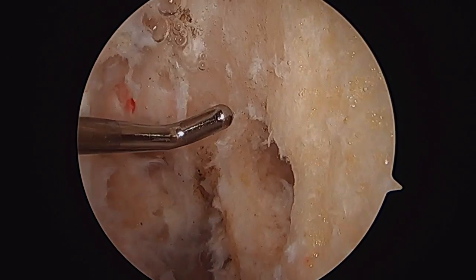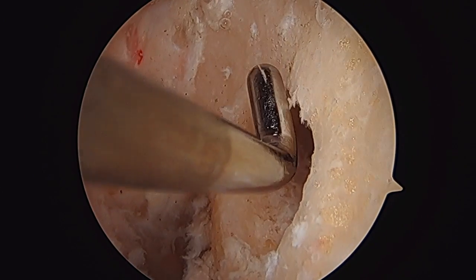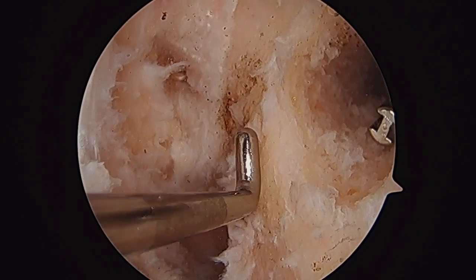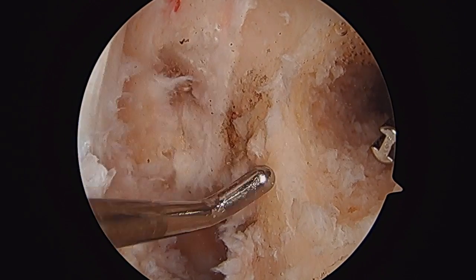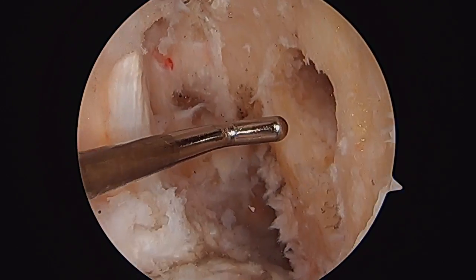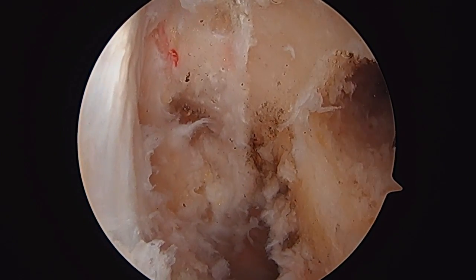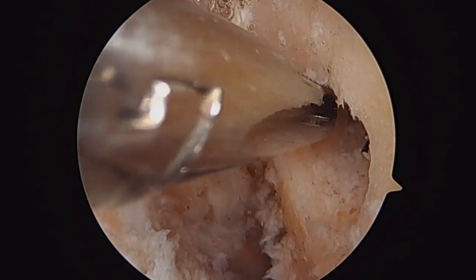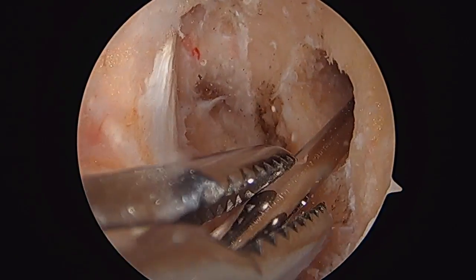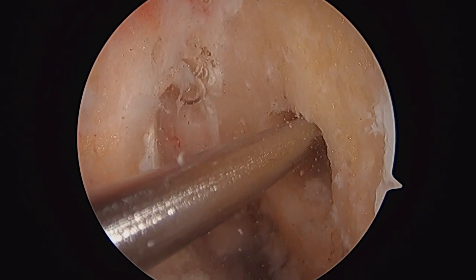So again, I like the placement. Again, it's below where I want. It's behind that anatomic footprint. I've got the back wall close to where I want to be. And this is the time where I'll do my final drilling, depending on the size of the graft being utilized. This technique can be used for hamstring grafts. It can be used for patella tendon grafts or allografts. Again, pulling the guide pin back out the anteromedial portal, and I'll prepare this for final drilling.